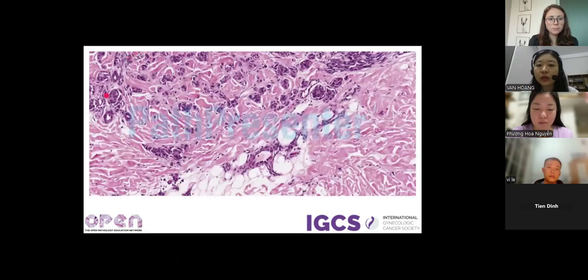So this is the bottom of the lesion. The melanocyte nests in the dermis here are smaller and less pigmented compared to above, and this is the evidence of maturation with depth. The cells become smaller, more spindle-shaped, and less cytologically atypical towards the base. There are no abnormal mitotic activities or necrosis. And we see here collagen bundles surrounding, with no invasion or destruction of surrounding tissues.